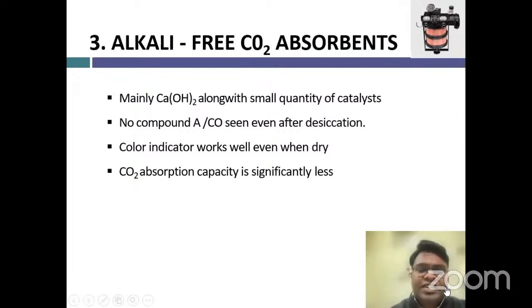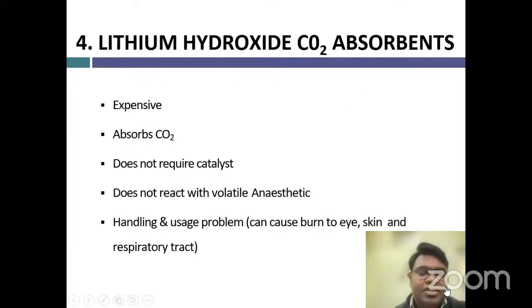Color indicators work very well even when dry. This property has been used to indicate dehydration in a high alkali absorbent canister by placing alkali-free absorbent at the side where fresh gas enters the canister. Lithium hydroxide absorbents are expensive and do not require a catalyst.